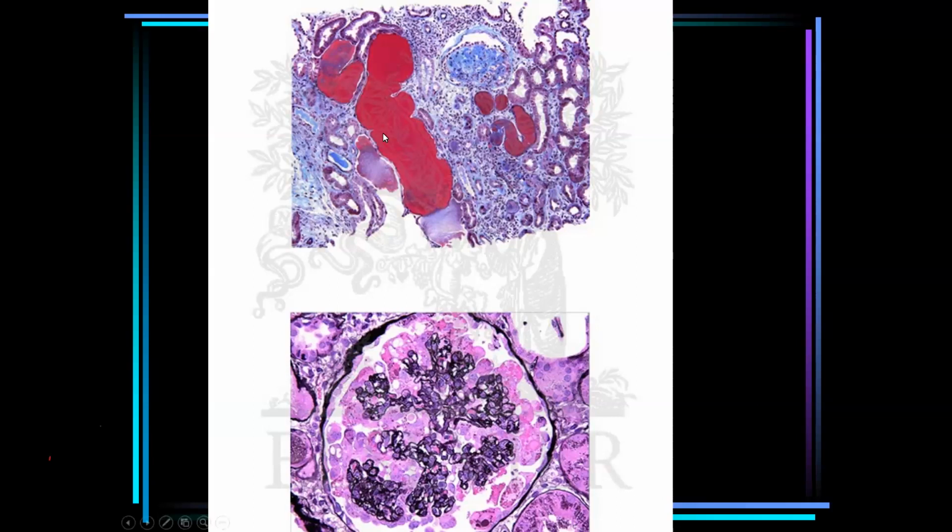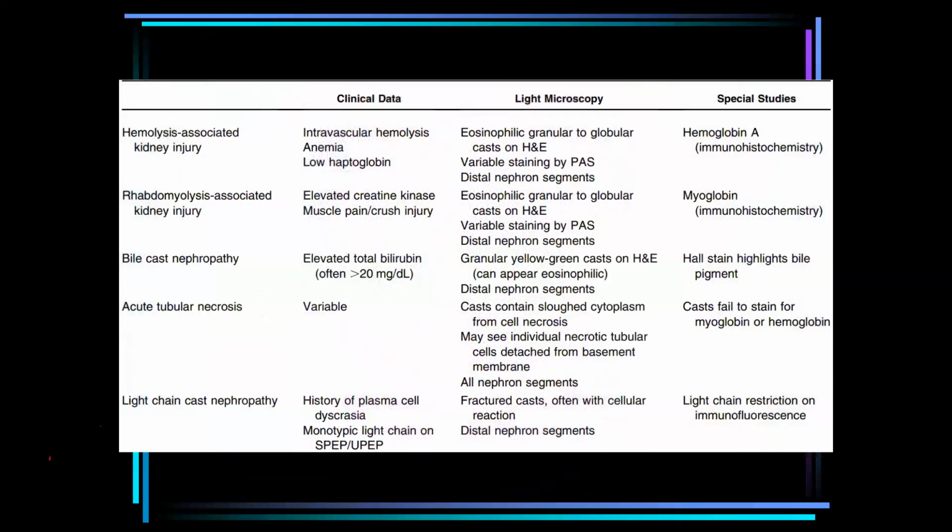So this is one of the conditions that we may see inside the renal tubule. Together with this finding in the glomerulus, it will help to diagnose the condition. Sometimes we don't know from the start that the patient has HIV. And as you know, in some countries it is not allowed to test for HIV except after telling the patient. So if you find a lesion like this, it may help to diagnose even the underlying disease, the HIV-associated nephropathy.